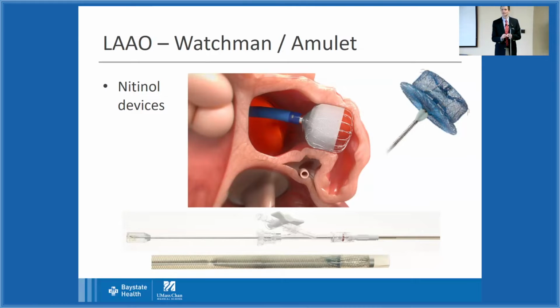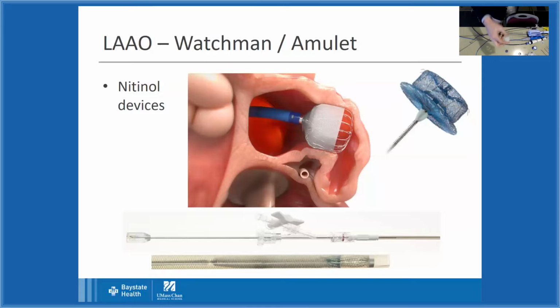So I'm going to show you here on the screen. I can take the device, squish it down into the catheter, and when I release it, it jumps back to the shape in which it was cast. Okay? So that's a concept that underlies a number of the devices we're going to be discussing today.